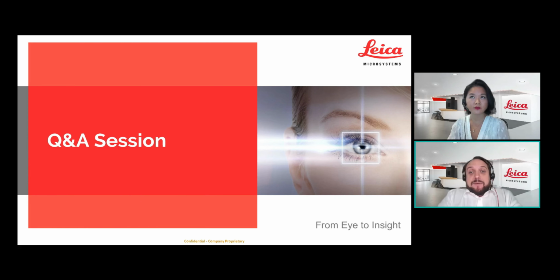Personally, I would recommend you automate it. It depends a lot on the patience of the people that are doing it. The nice thing, if we use the bioassembly bot, is that we can wait to do the staining until just before the slide goes into the imager. So while one slide is imaging, the next slide will be staining. And we can do 15 slides at once. So you would take 15 slides through a round of biomarkers in a day quite easily.